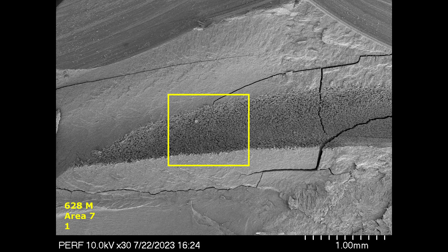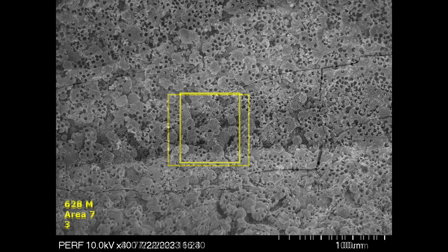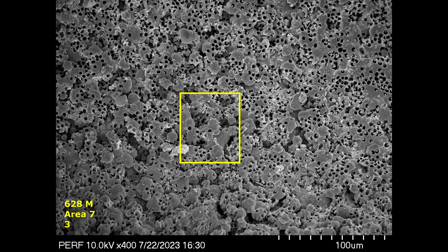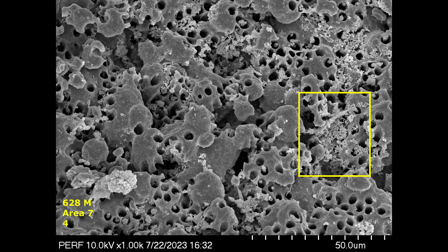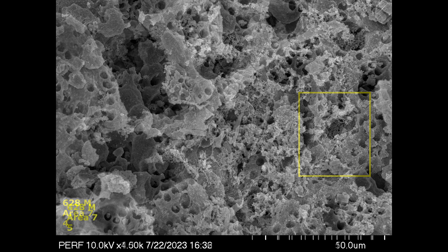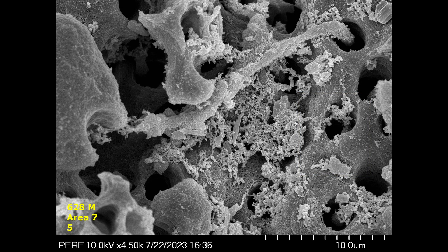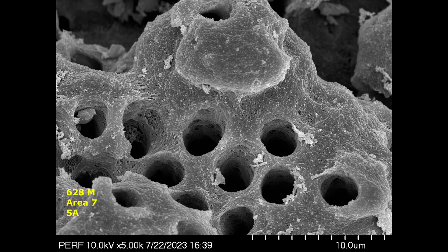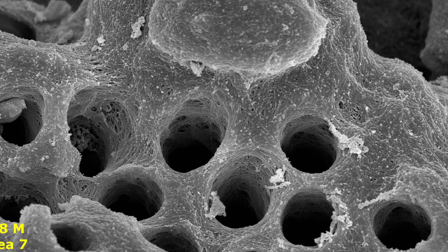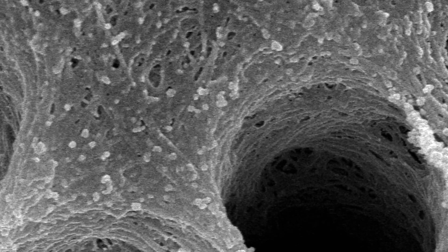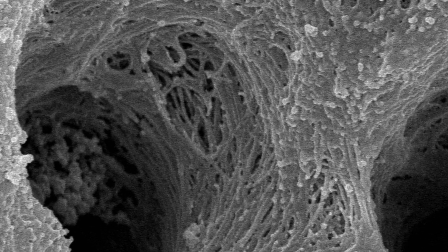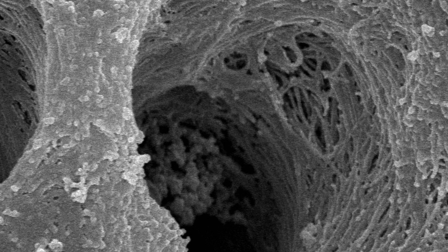When you go into the area where there was no pulp — up coronally, where the 1403 removed all of the pulp — and you look at that dentin, it does have that GentleWave appearance to it. Looking carefully at the peritubular dentin, that has all been decalcified. You can see a relatively strong decalcification and the collagen nature of the dentinal tubule with no peritubular dentin.